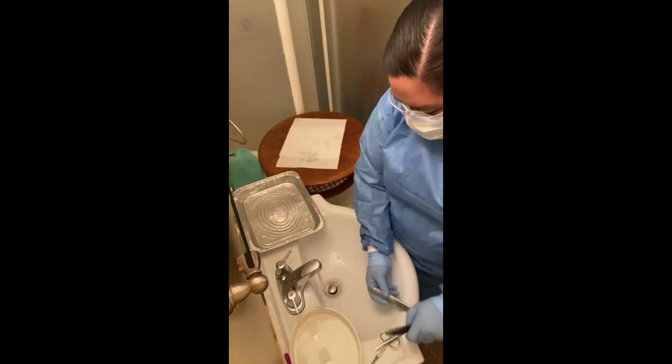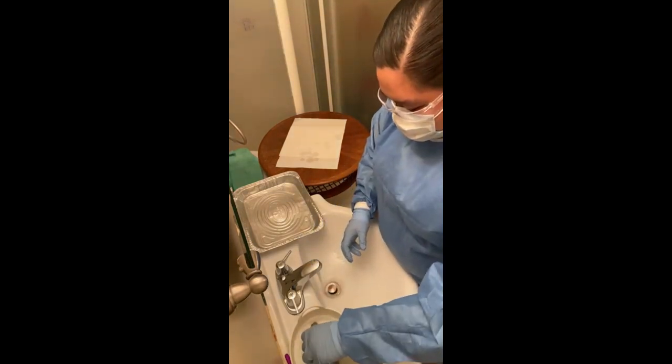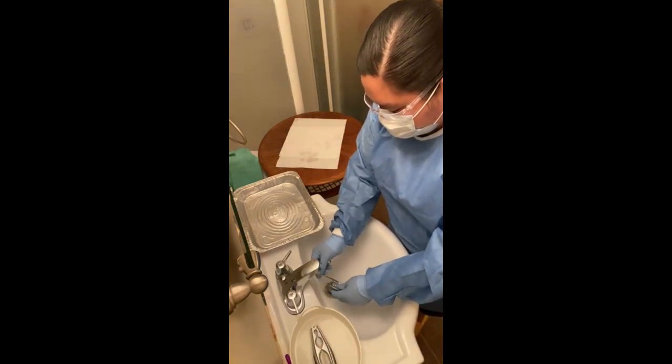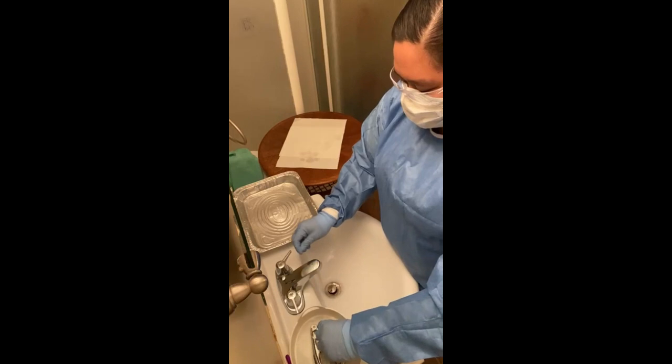Remove any visible debris from instruments by rinsing them under running water or soaking them in an enzymatic solution. Pre-cleaning helps to prevent the drying of organic material like blood or tissue, which can be harder to remove later and may harbor harmful microorganisms.